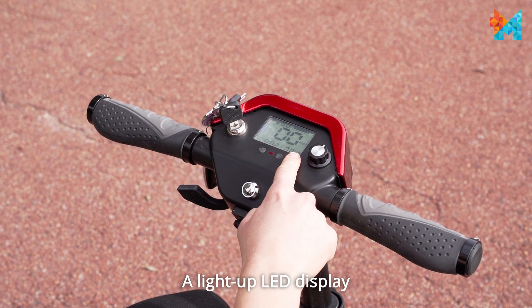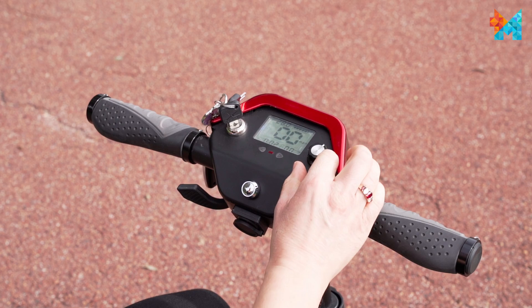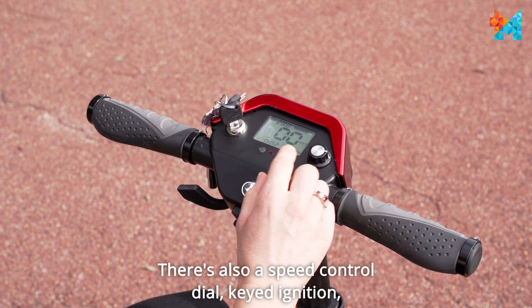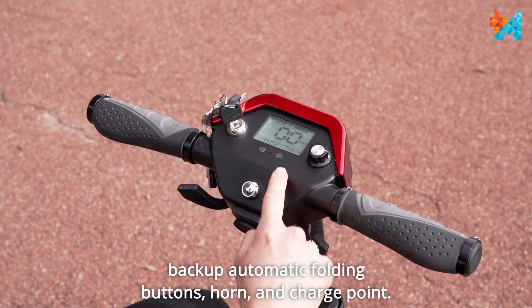A light-up LED display includes your speed and battery indicator. There's also a speed control dial, keyed ignition, backup automatic folding buttons, horn and charge point.